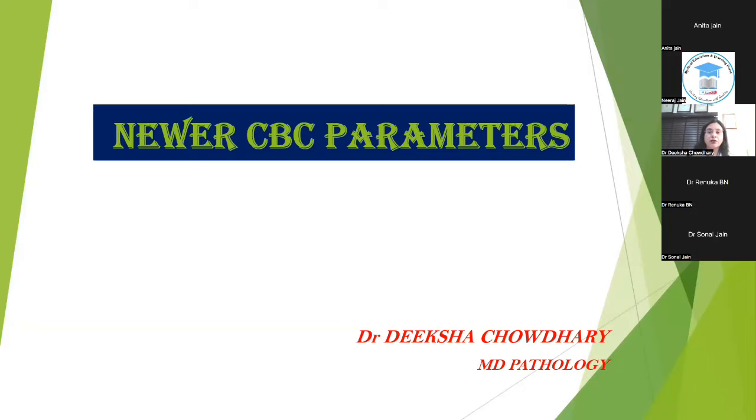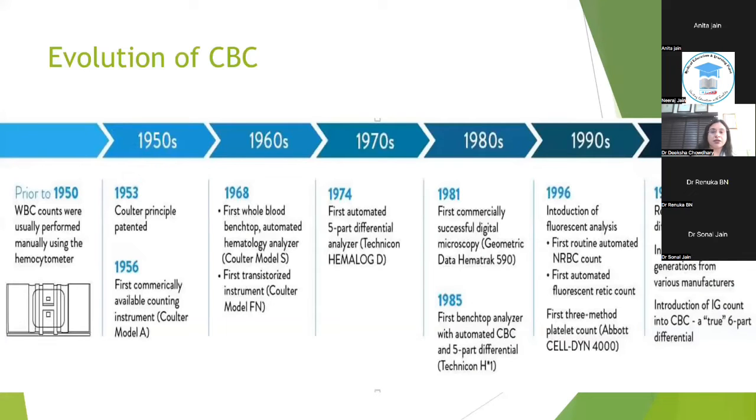So today I'll be talking about the CBC parameters which are new to the conventional ones. CBC is, as Sir has already told, a widely used test. It's the most frequently ordered test in our labs. And the evolution of CBC has gone through a long journey.